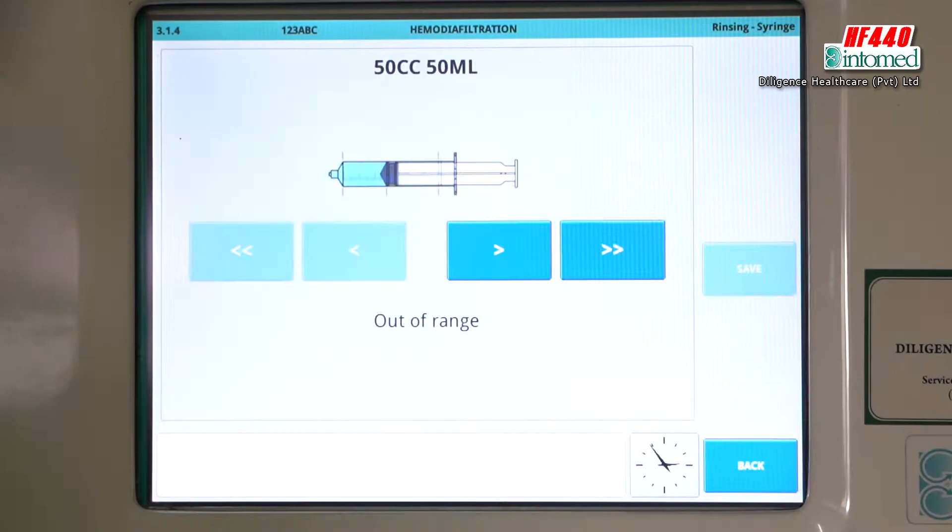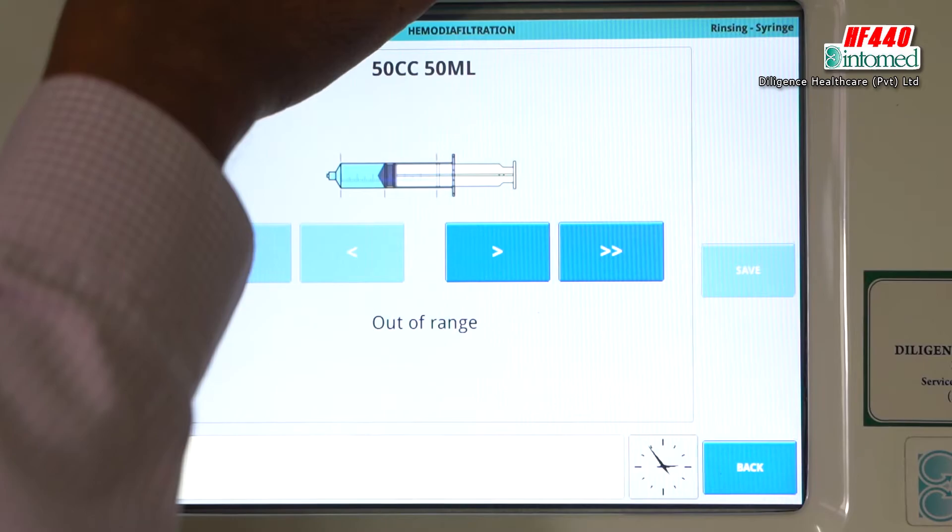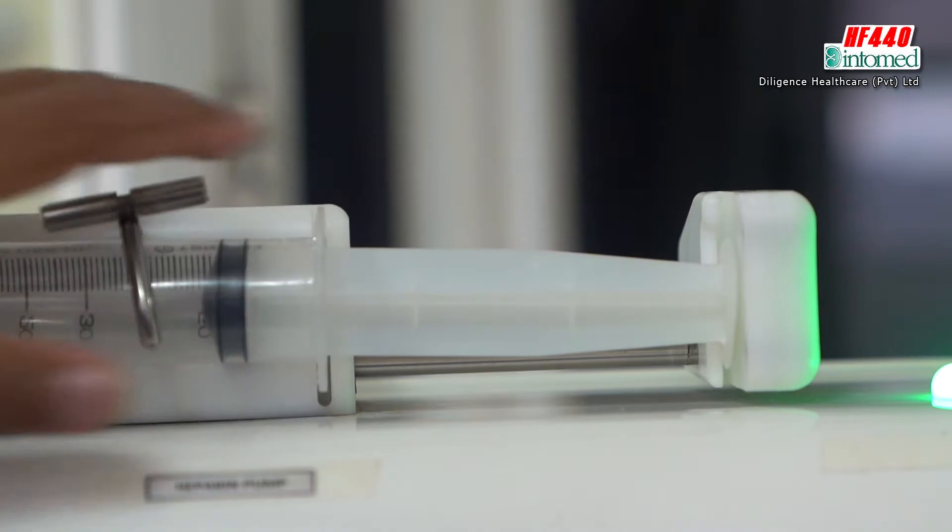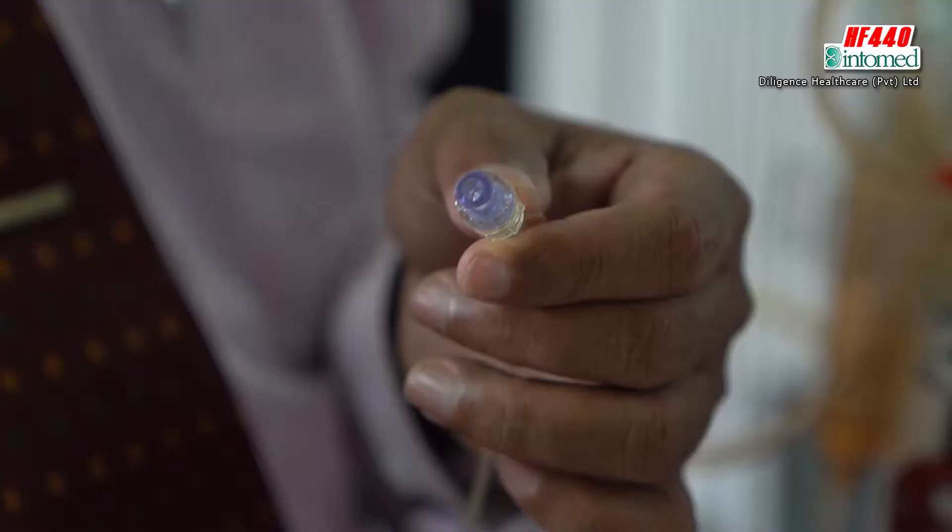Add syringe, you have to insert whether 50 cc or 20 cc, whatever the syringe you have to select and adjust the tail part of the syringe pump accordingly to the syringe.